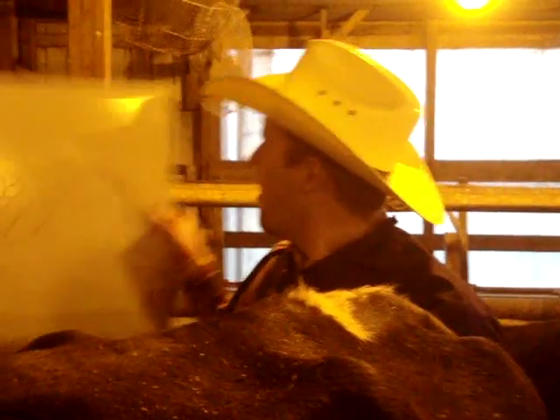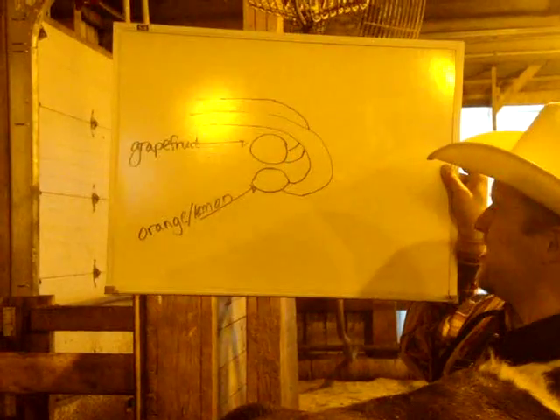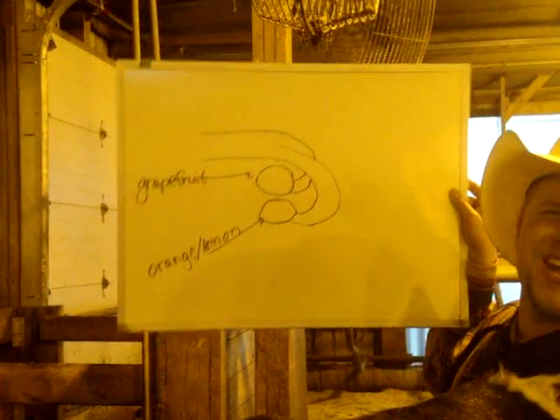Your follicular cysts got more of a grape-fruity texture to them, while them luteal cysts — they're more like an orange, but it was more like a lemon. That's what I like to say. So if you can think of that in your mind, that's the basic picture you're gonna be seeing in this heifer right here. As you can see, one texture on the right and another on the left.